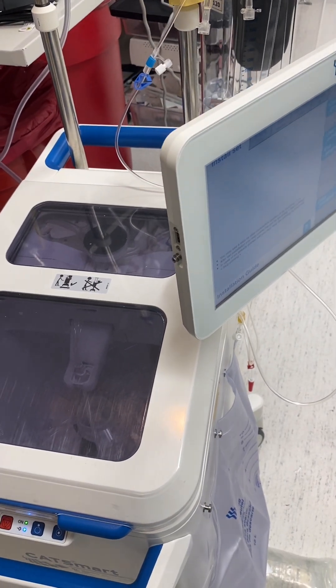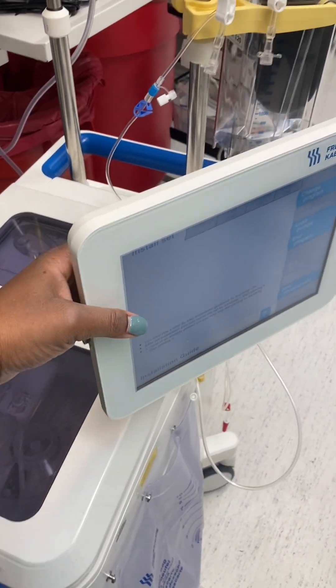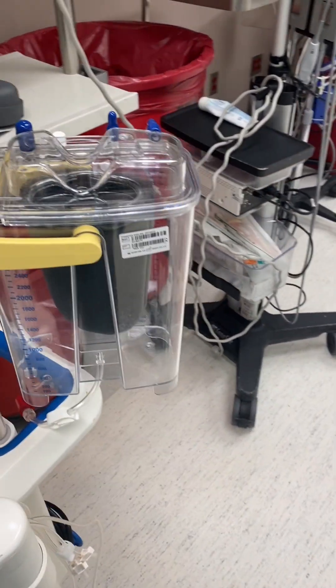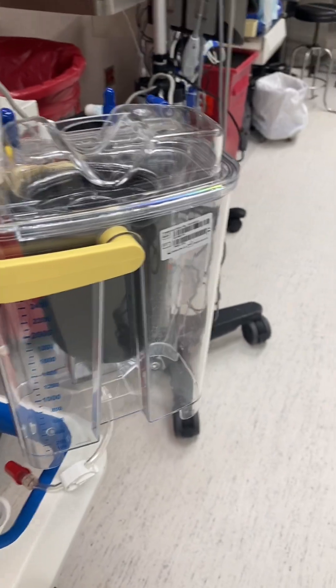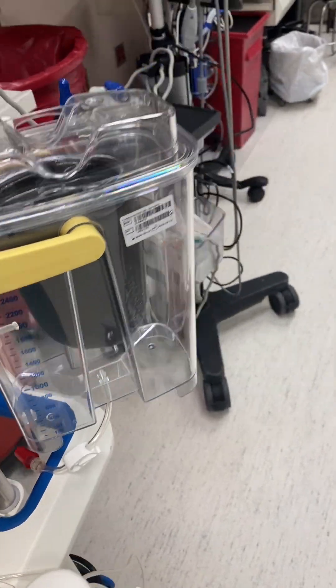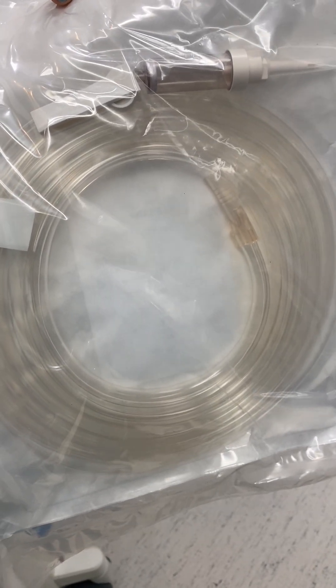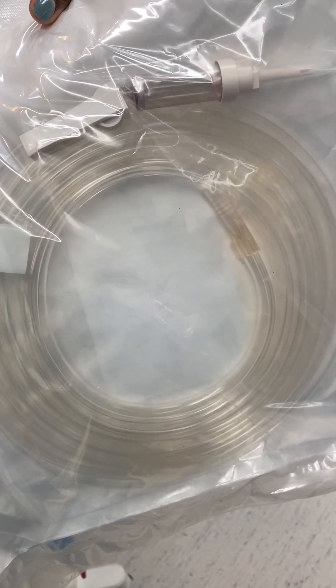There are many machines on the market, but this is one of the machines that are out there. Blood will be sucked back to this reservoir. With this, it's a double lumen suction line.